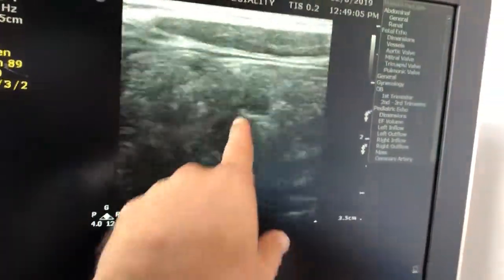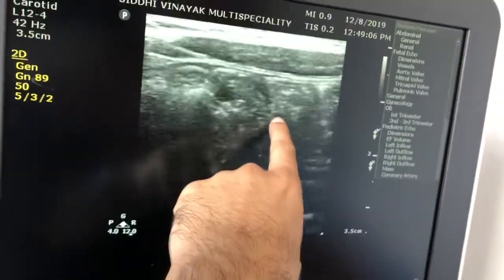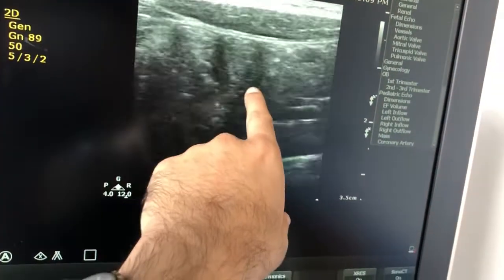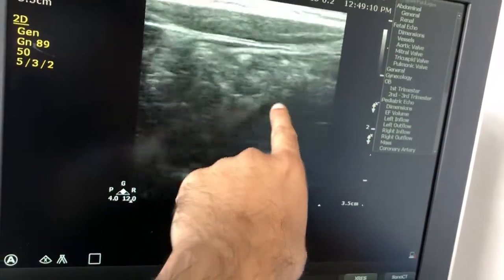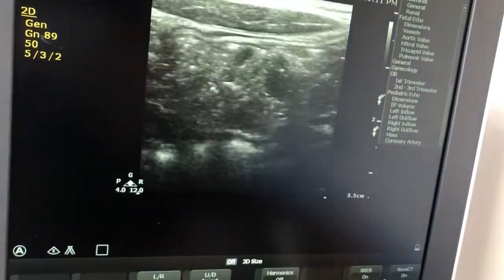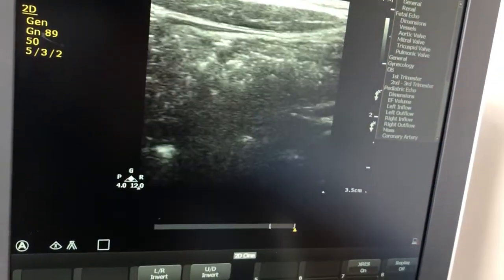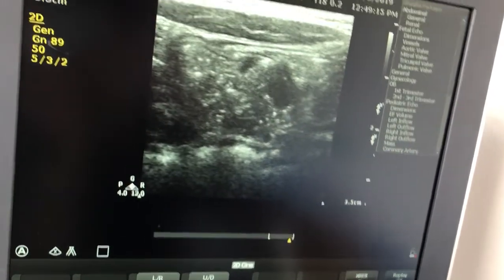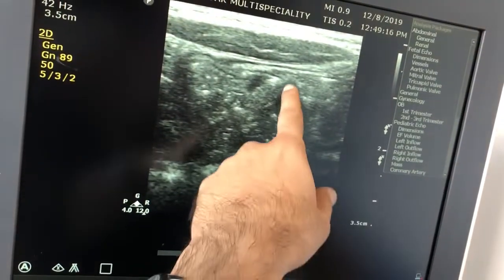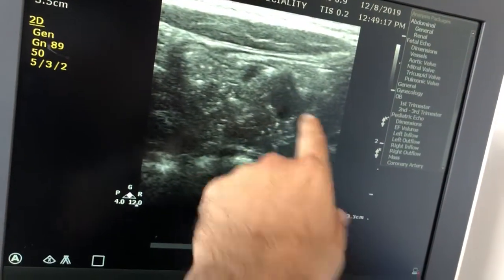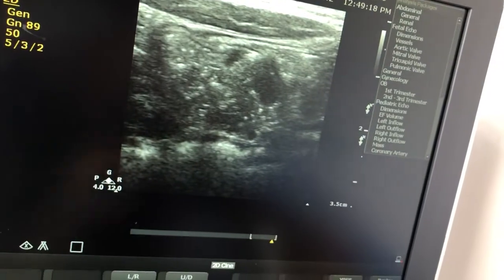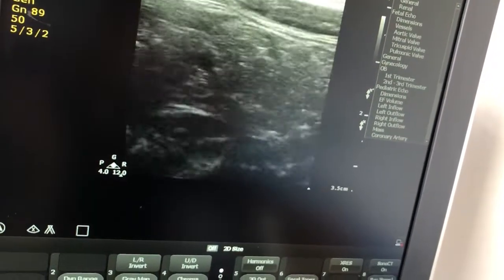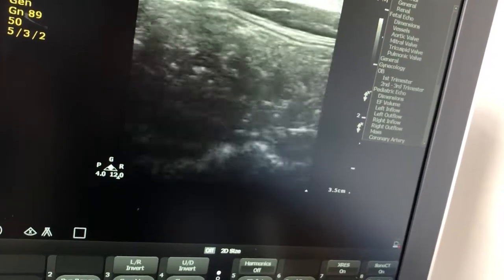This is another area where I am scanning. Here also there is a cystic-type structure which is having a similar shape and size, which is more in favor of the ova of the parasites.